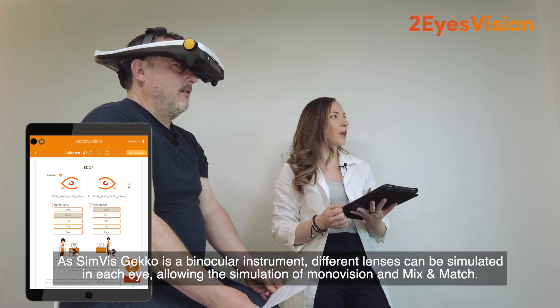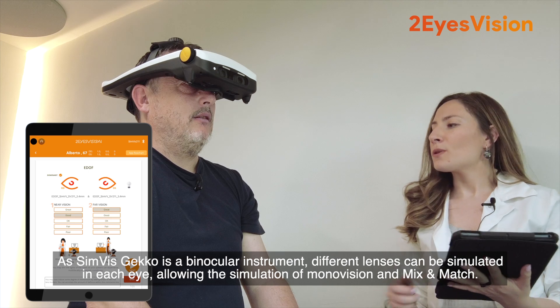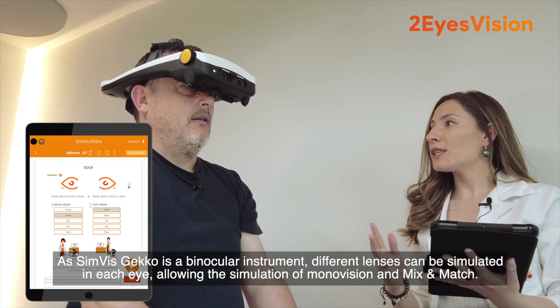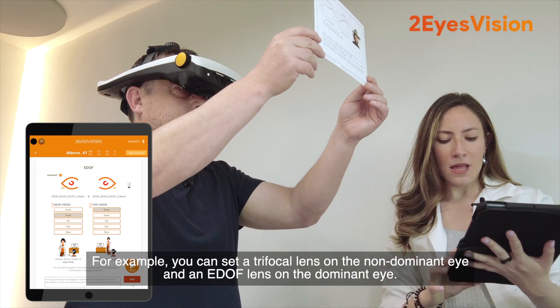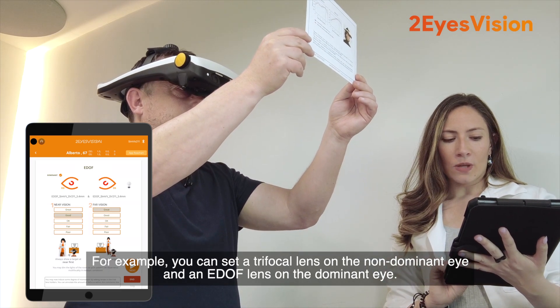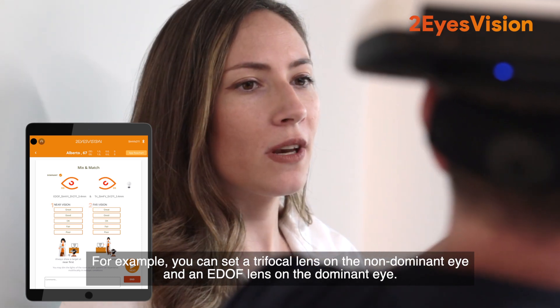As Simvis Gecko is a binocular instrument, different lenses can be simulated in each eye, allowing the simulation of monovision and mix and match. For example, you can set a trifocal lens on the non-dominant eye and an EDOF lens on the dominant eye.